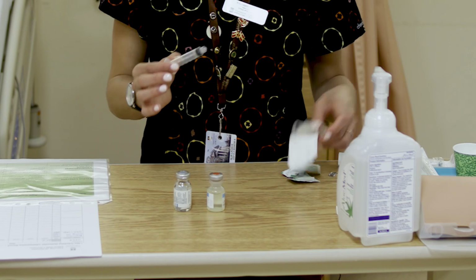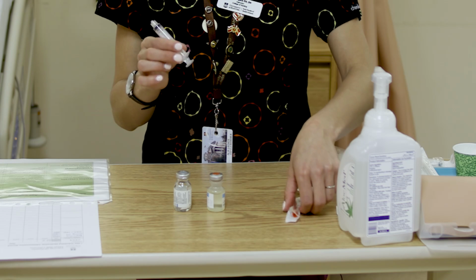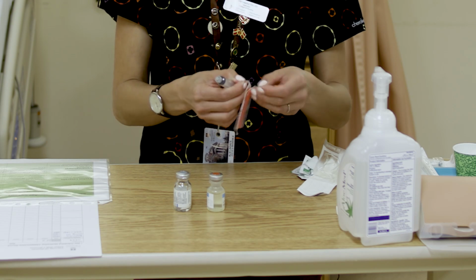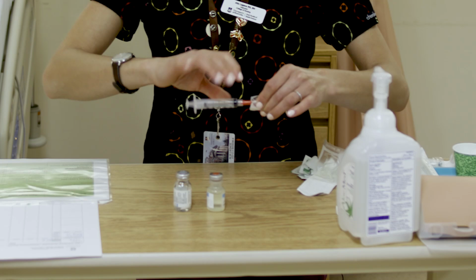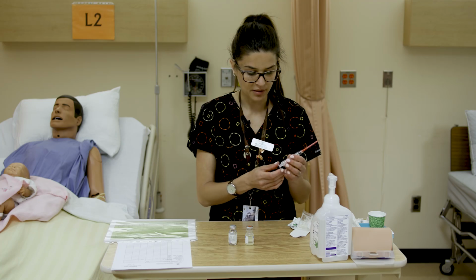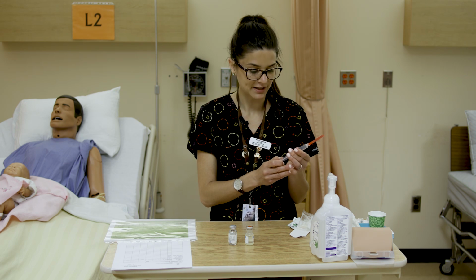Only touching the barrel of the syringe and not contaminating any of the sterile aspects of it. And then same with our blunt fill. You would be using a new one, right? We're using one that's been opened. So you just would pull back and then not touch the hub of the needle, attach it via the luer lock system. And we're going to move around our plunger a little bit just to unstick it again.